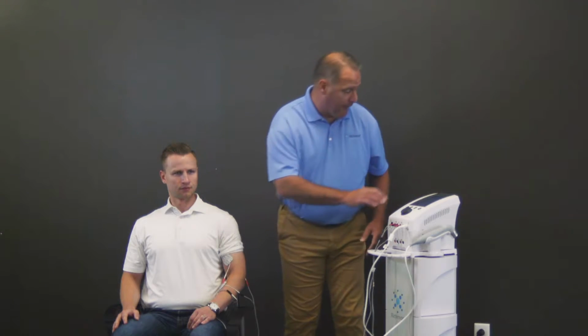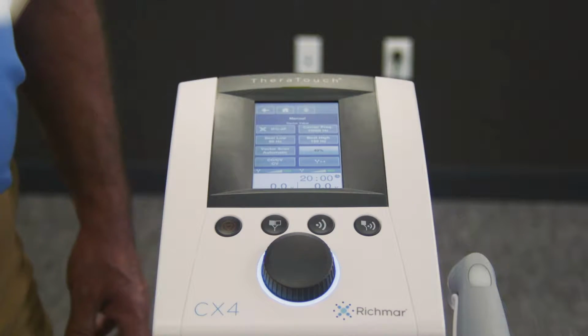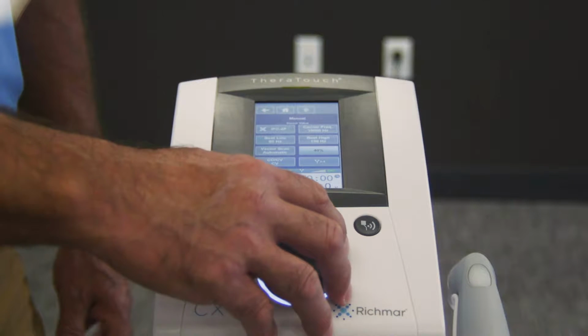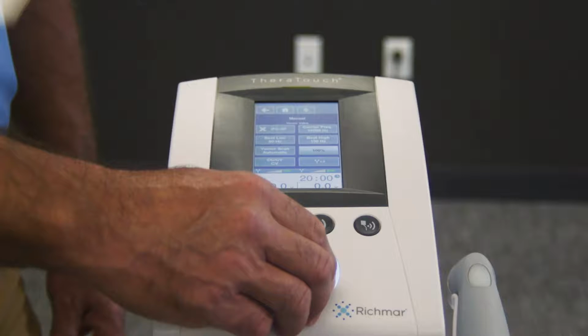So right now, if I go into vector scan, we'll turn it on. You normally have a choice between manual and automatic. I would prefer to use automatic, and then you also have the ability to change the percentage of the power change, normally from 20% all the way to 100%.